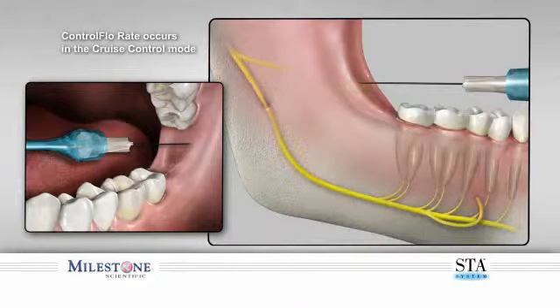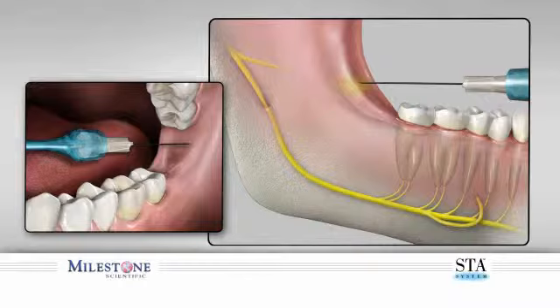This allows the control flow rate to continue to dispense anesthetic solution, creating an anesthetic zone in front of the tip of the needle. The technique of creating an anesthetic pathway does require a very slow and deliberate needle movement, allowing the anesthetic solution to deliberately precede the path that the needle will take.